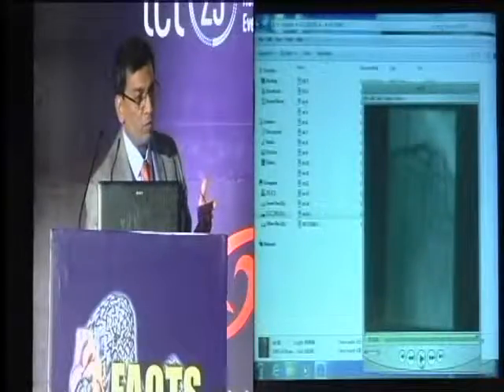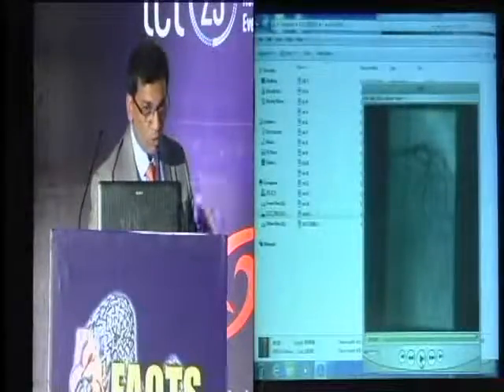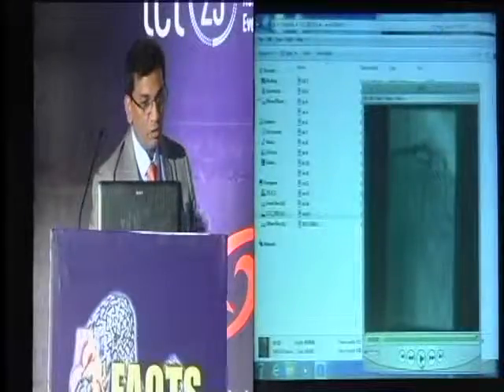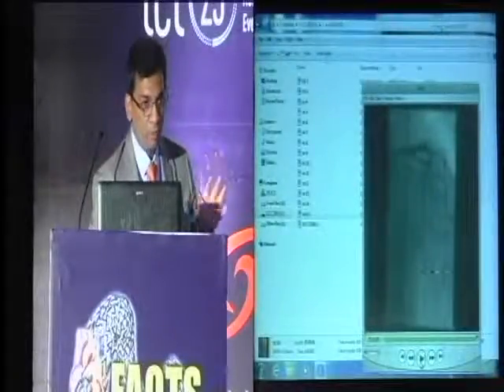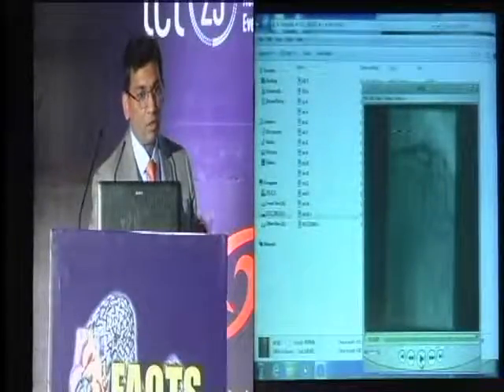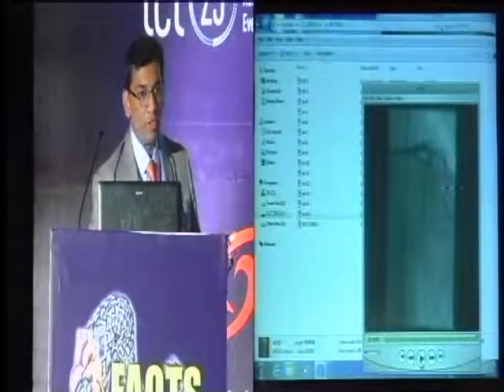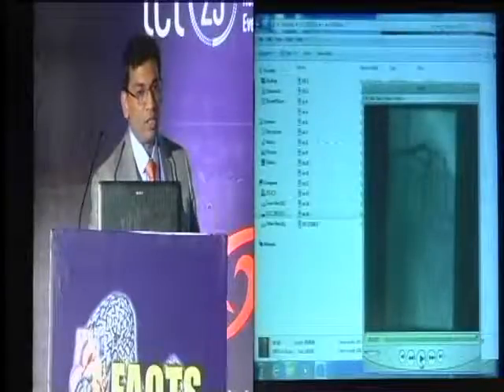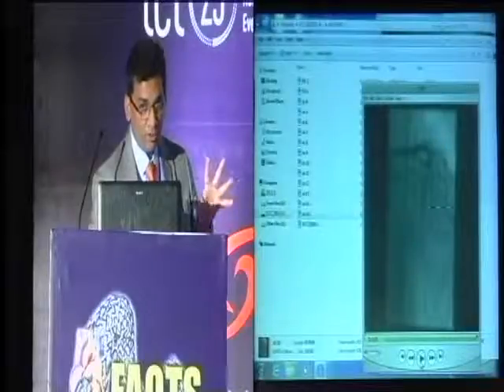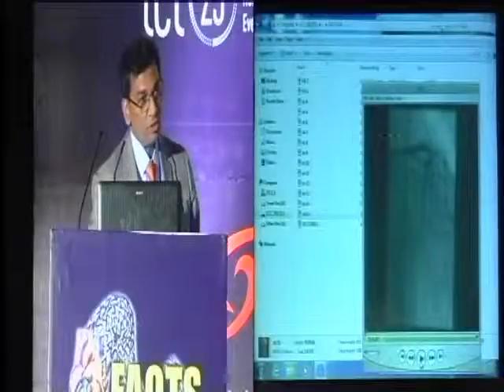Open up both the vessels and then decide which one you're going to stent based on which of the two has the more unstable lesion. In acute MI presentations, managing the thrombus before you commit to stenting is a very important aspect. That allows us to properly assess the vessels and stabilize the patient hemodynamically, then you have time to decide, and then splay the vessel properly so you can see the ostium of the branch, and then stent the vessel which is more unstable.